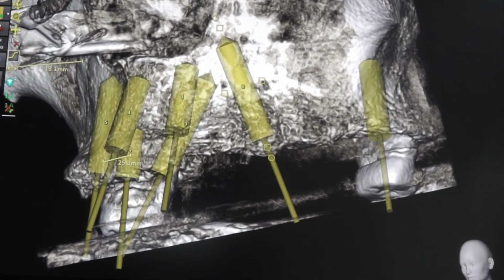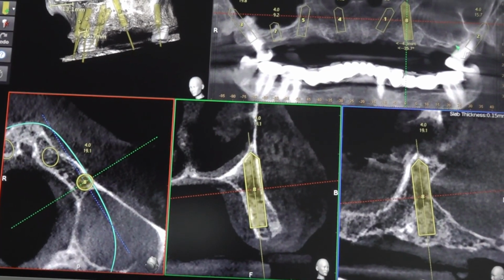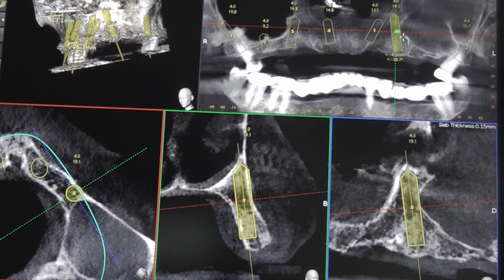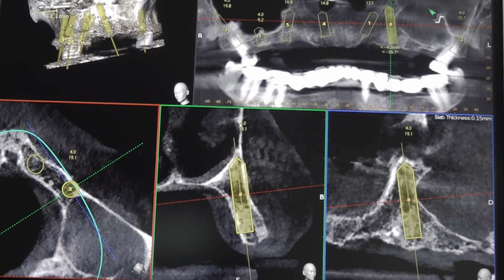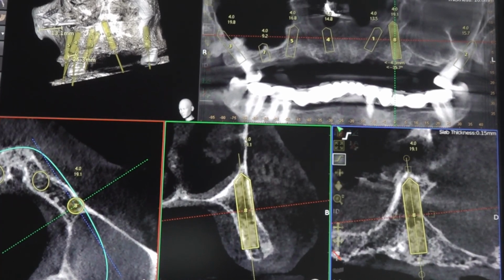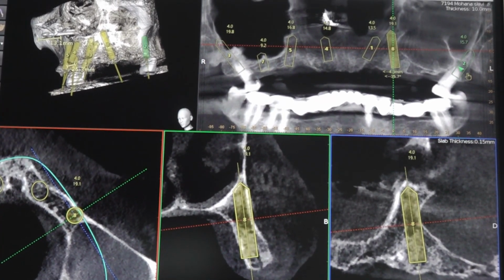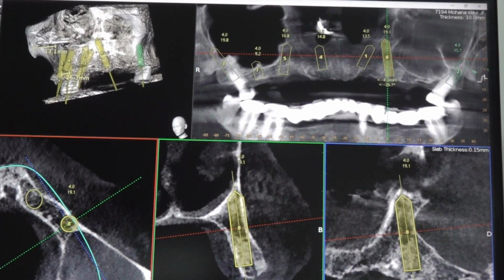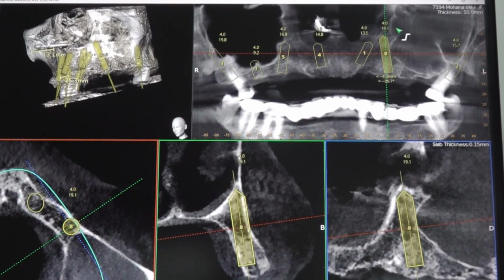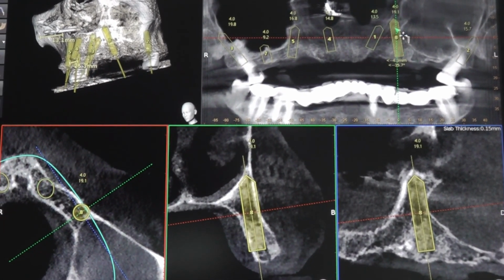Okay. Next time you can see this outline through the bone. It will be paper thin here, like a transparent sheet, as during zygoma implant placement, when you are doing a zygoma implant it will be visible.